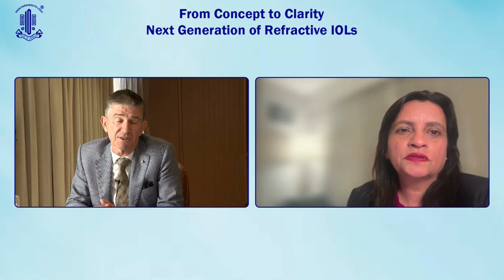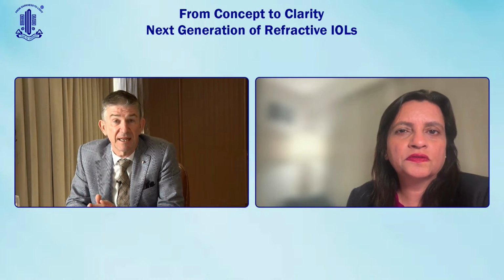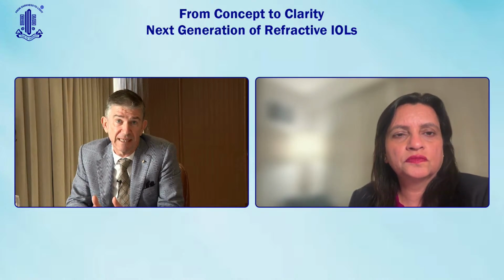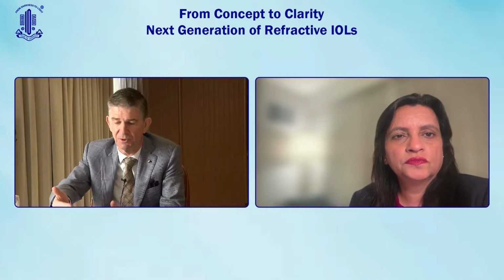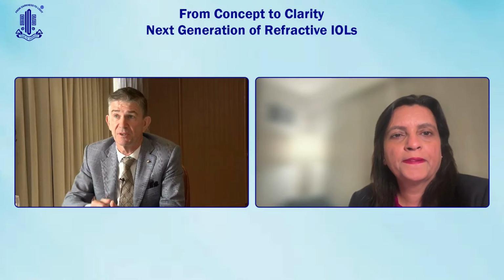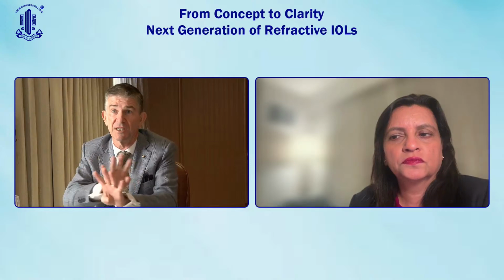Yeah, again, I think the Eyhance delivers very high quality vision. In fact, there was a very interesting editorial published, I think, in the August edition of the Journal of Cataract and Refractive Surgery, authored by Professor Filomena Robera, the president of the ESCRS. And she made a very interesting case that the new standard of care should no longer be a monofocal lens. It should be an enhanced monofocal lens, because the data shows that you get a tangible improvement in intermediate vision without any penalty of dysphotopsia, without any penalty of a drop in contrast sensitivity. So I think that you can use the monofocal and the Eyhance interchangeably.